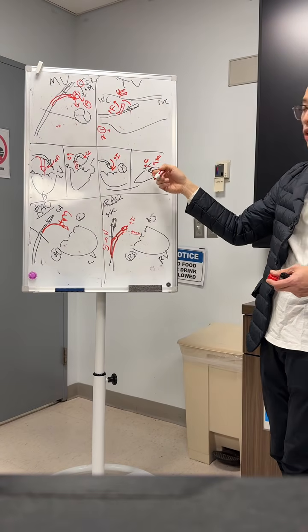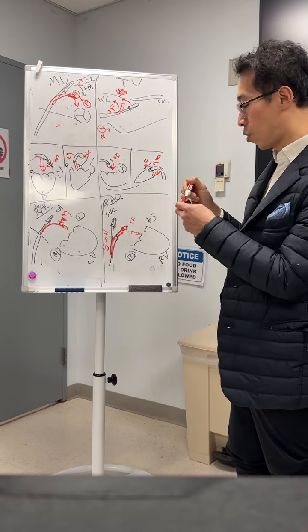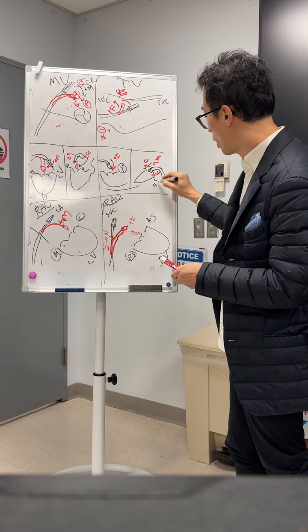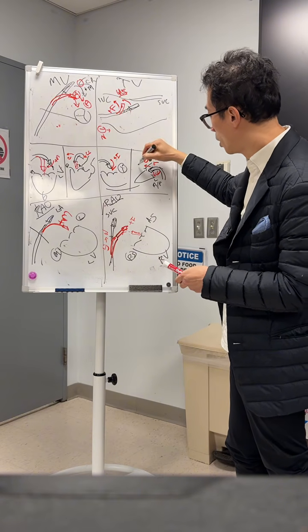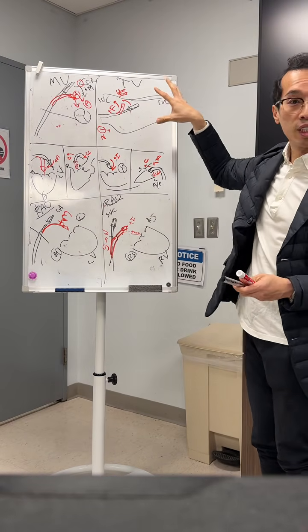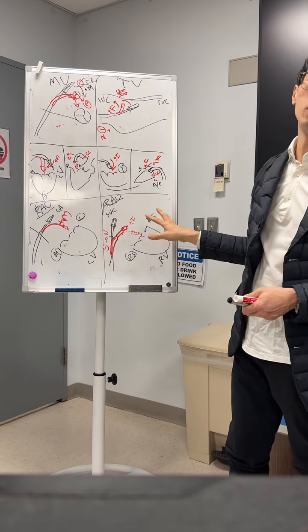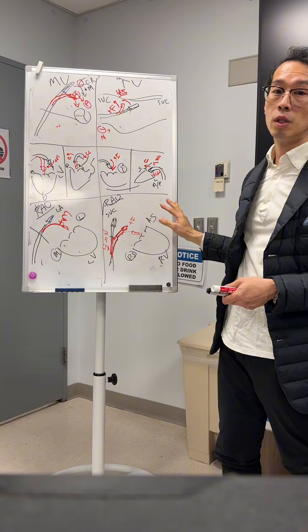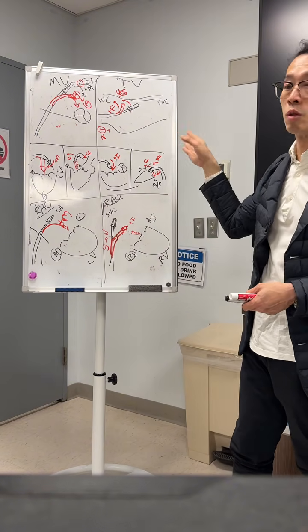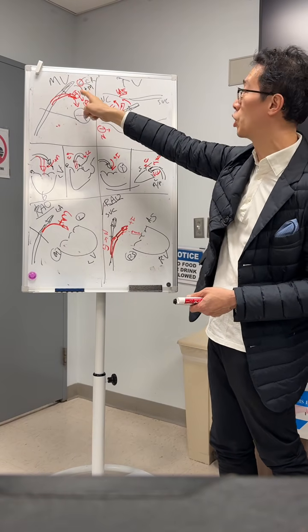Okay? Same principle here, right? Counterclock is more lateral or A or P, depending on where you are. And then if you clock, you get more septal. Does that make sense? Because this is the same, again, analogy between echo and fluoro. Fluoro remains the same. The workflow is the same. How you steer down is the same. The view, of course, is different between mitral and tricuspid, but mitral, you do the same thing once you straddle in the LA. The imager showed you this.